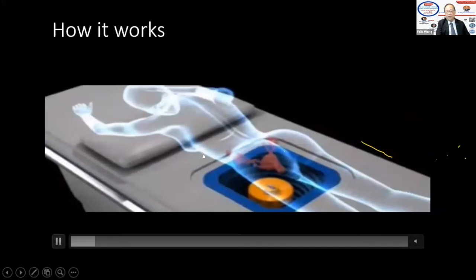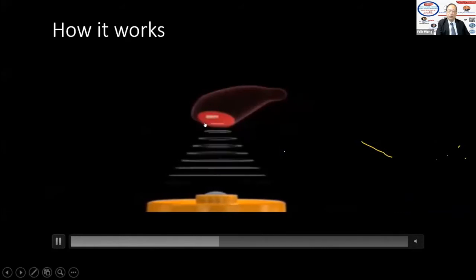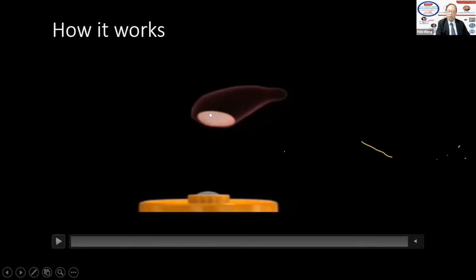Now, the treatment is like this. You can see the patient lying on the machine. There's the uterus, and the transducer sends the focused ultrasound onto the lesion. You burn point by point, and when you think it's not enough at the anterior, you burn the anterior as well. Usually you burn more at the back, because once you burn the anterior, it may prevent more ultrasound from going to the back. This is one of the principles we should use.